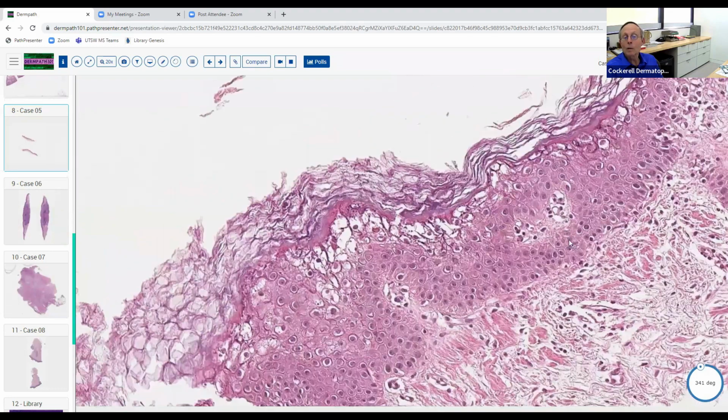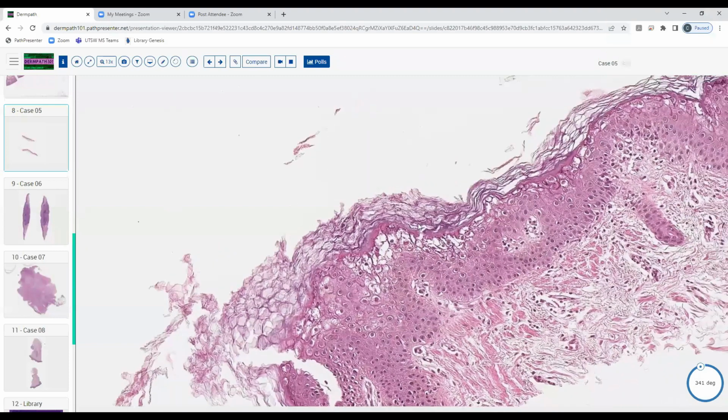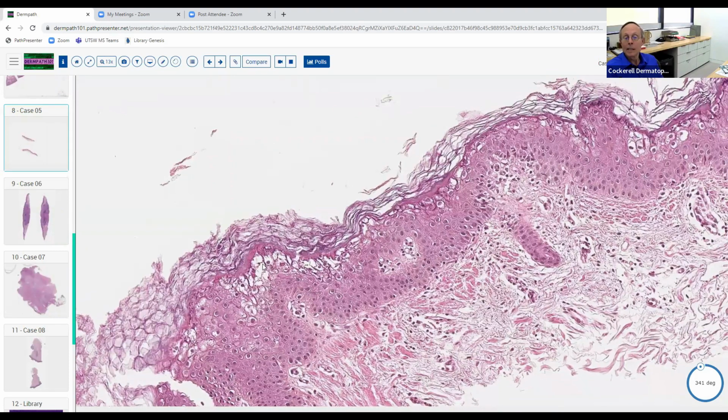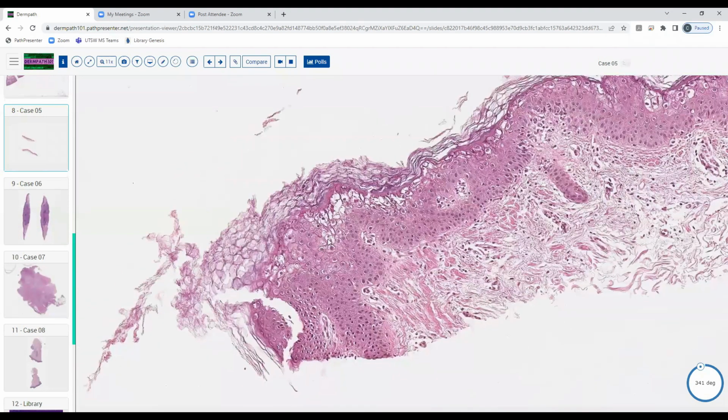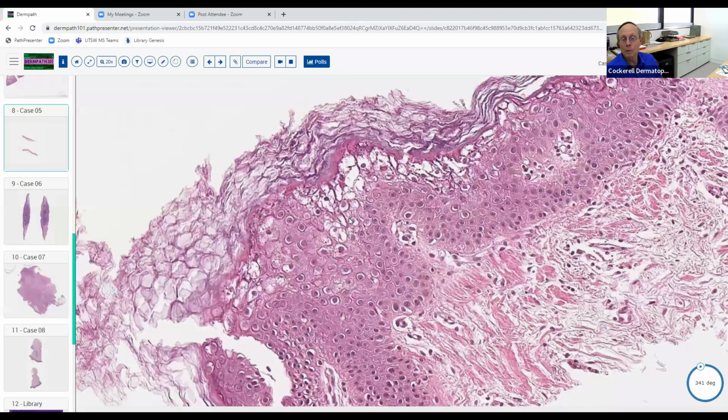So we talk about epidermal reaction patterns. This is one of about 25 or 30. And so what are some diseases where we see epidermolytic hyperkeratosis like this? So I was thinking that this could be an ichthyosis. It could be an ichthyosis. And which type of ichthyosis do we talk about here? A congenital ichthyosis. Yes, it would be one of the forms of congenital ichthyoses, and you'd see this patient at birth. What do you think they would look like at birth? Kind of like a collodion membrane. They might have a collodion membrane.